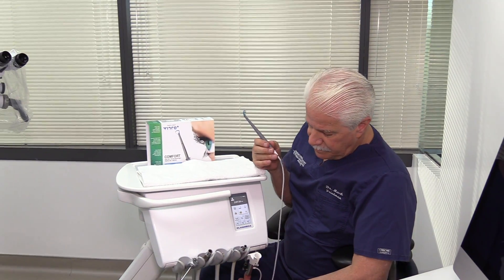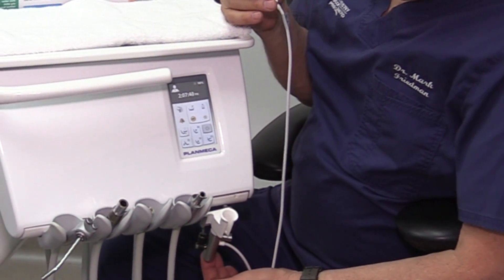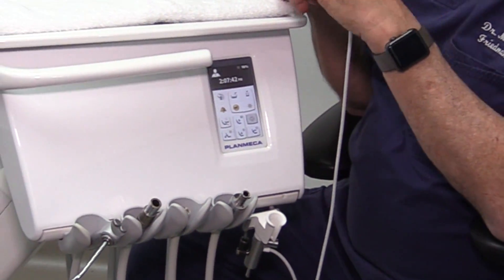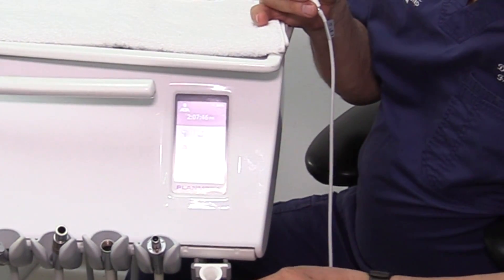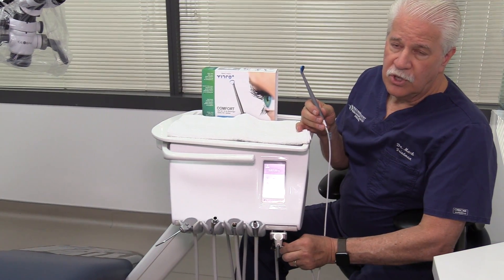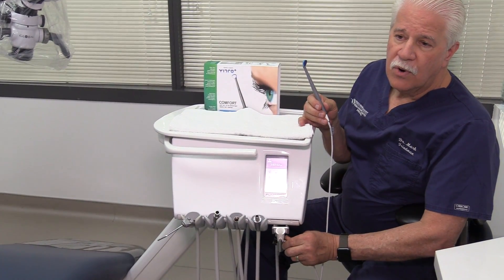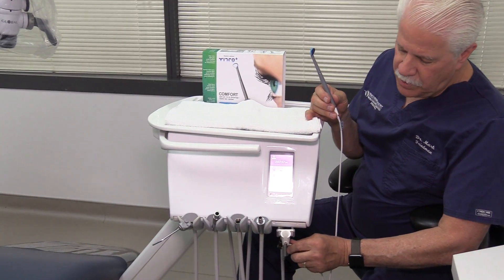There's a switch at the bottom that you would activate, turning the air pressure on. And once that switch is activated, you have an adjustment to adjust air pressure, so you can either have minimum pressure or a lot of pressure, depending upon whether you're creating a large spray or minimum water spray.